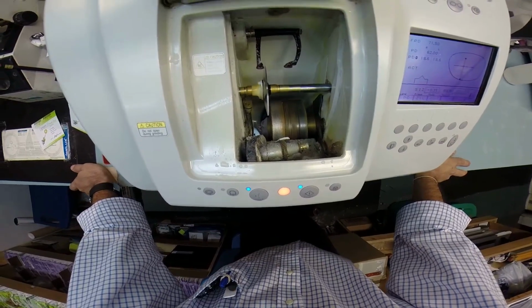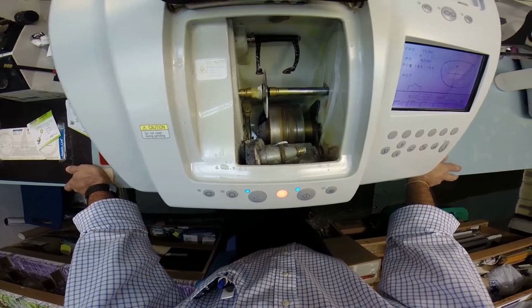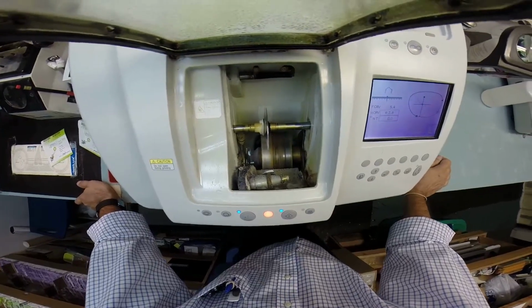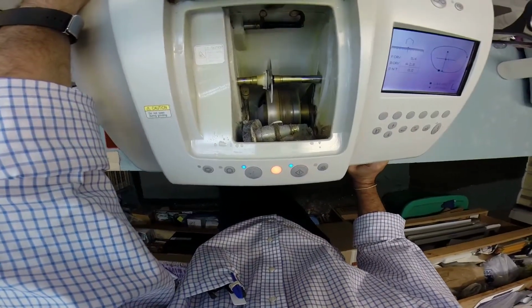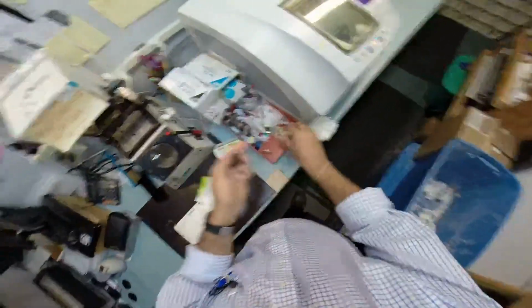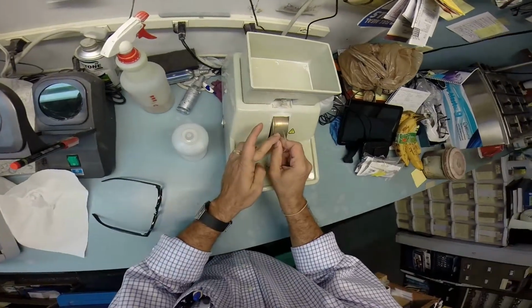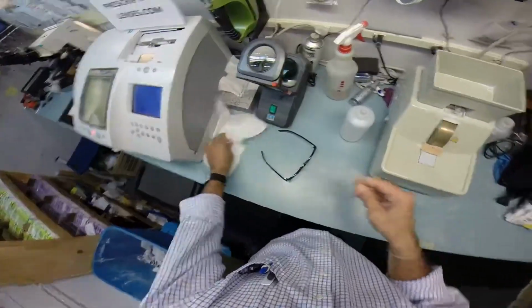And once this begins cutting, I will keep working on the right lens. I'm going to take it down by hand. I'm going to go old school on the old hand stone over there, making the lens smaller. I could have the machine do it, but for the sake of time, I'm going to do it the old school way. So once this drops down onto the cutting wheel, run back over here. So this block is no longer needed. I'm going to take that off. Go ahead and pull that sticker away. And I'm going to take this down by hand just a little bit more, just so years from now this is going to be easier for you to pop out.